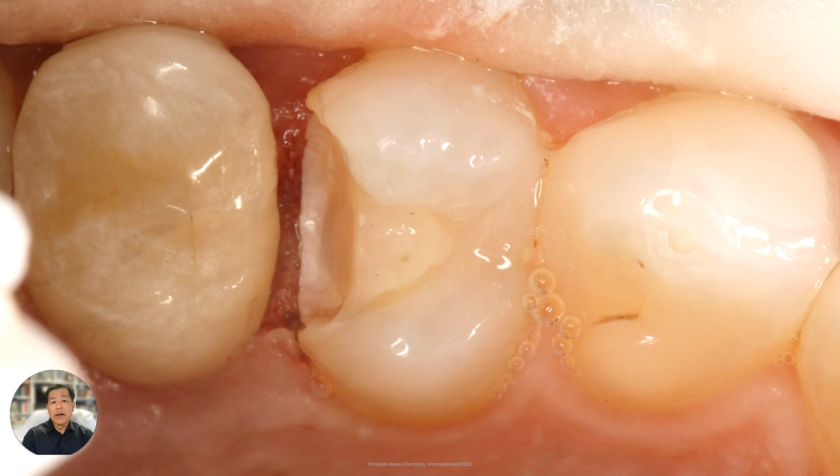And you can see how well that dries everything up. Now I can see, do I need to go back in there and remove some more of the restorative material? Do I need to remove some more decay? I'm going to finish up my line angles and kind of smooth everything up. But we went from that bloody mess to now having it nice and clear, and I can actually get in there and refine everything.